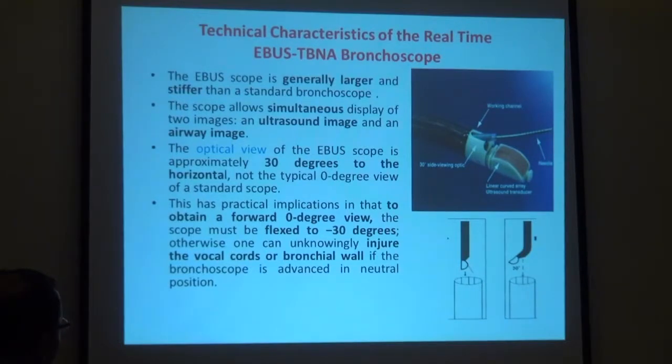فالنقطة الرئيسية إنك تعرف إن الفيو دي مهمة جدا. طب إيه أهمية القصة دي؟ إنك ممكن، زي ما الدكتور حسن قال لكم، تعور الفوكال كوردز. إنت شايف الفوكال كورد قدامك، تيجي تدخل تربط، القصة كلها أول ما تشوف الفوكال كورد ترجع المنظار ورا وتبقى شايف الحتة الأنتيريور كوميشر وتدخل، رغم إن ده مش الطبيعي لكن هو ده الموضوع. تاني حاجة، وإنت بتشتغل تلاقي في الأول إنك عمال تخبط في الإيرويز، فالقصة كلها إنك لازم ترجع المنظار لورا. طول ما إنت مرجع المنظار لورا يبقى بتشوف أنجل زيرو عشان تلغي الأنجل ب 30 دي.